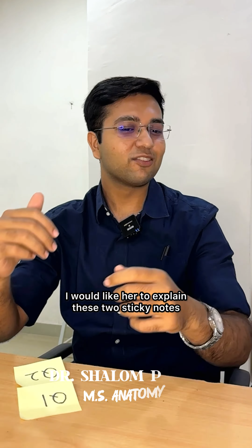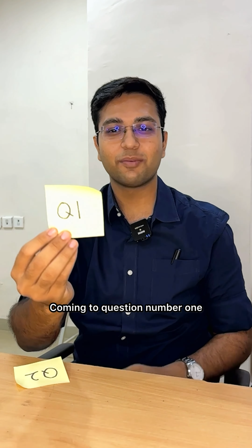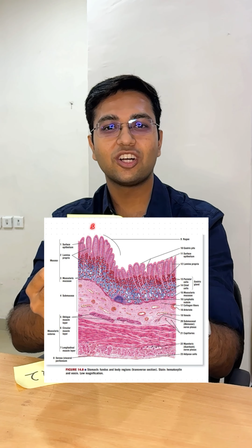I would like her to explain these two sticky notes which I have in front of me. So without further delay, let's get started. Coming to question number 1, it is: identify the given histological slide.